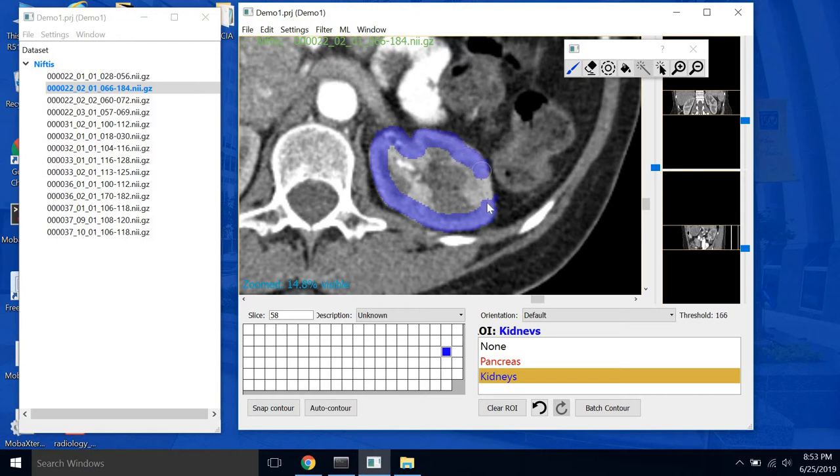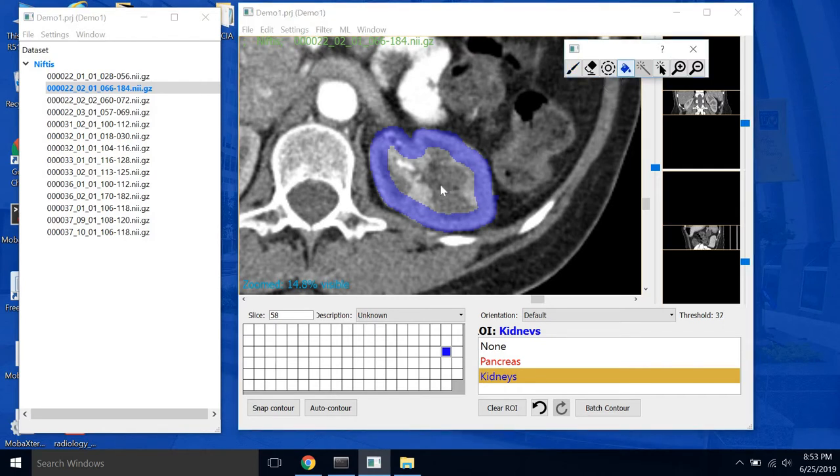So once we have the edges of the kidney traced, you can click this paint bucket here to fill in the center.